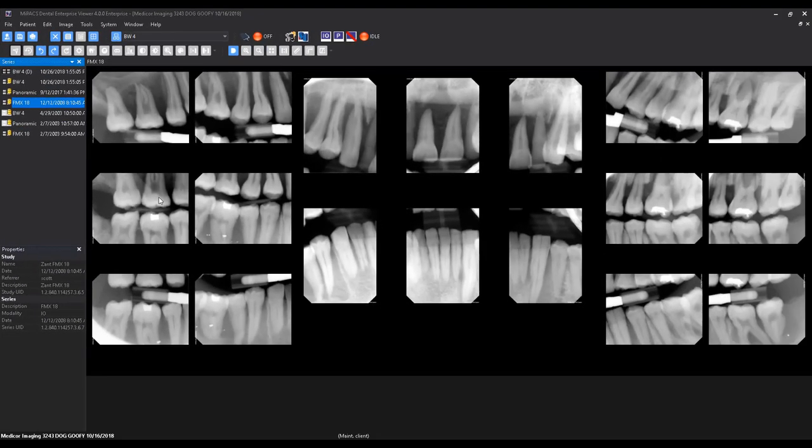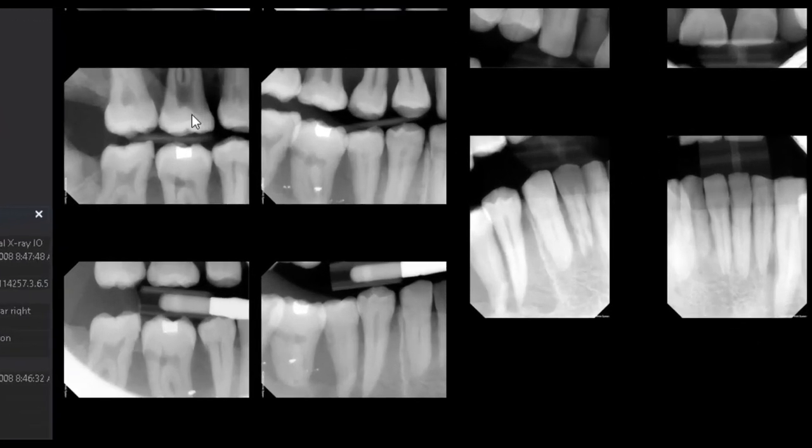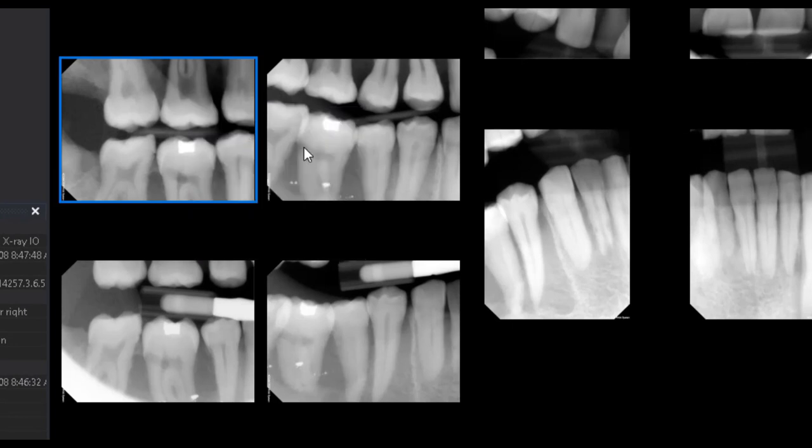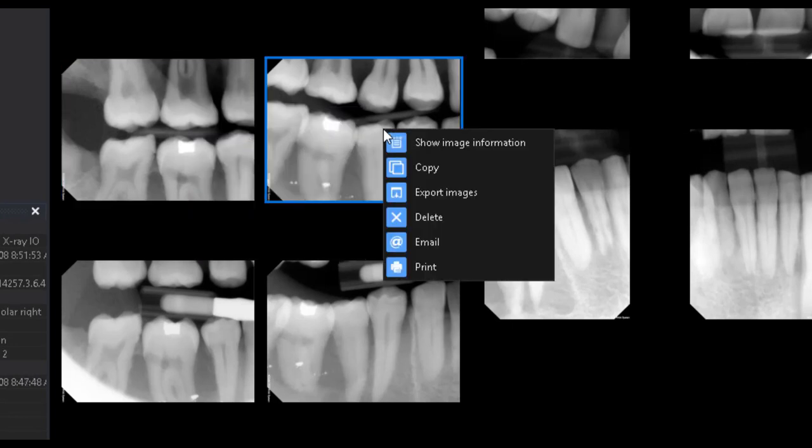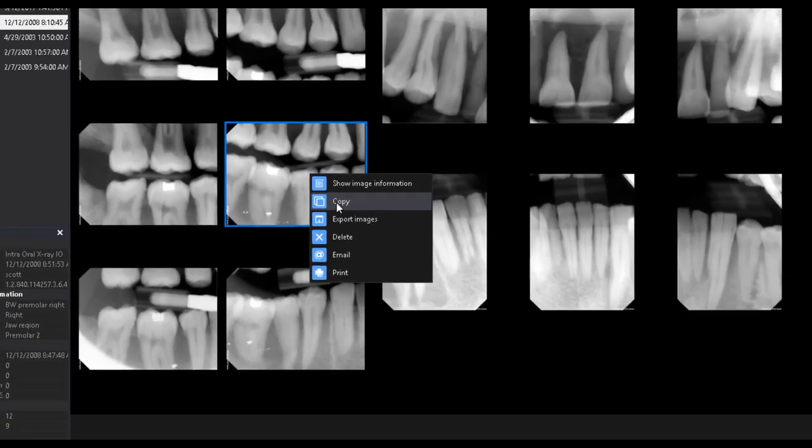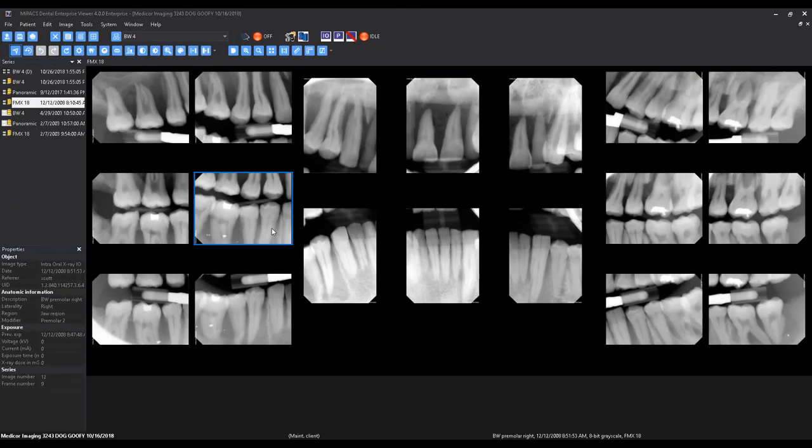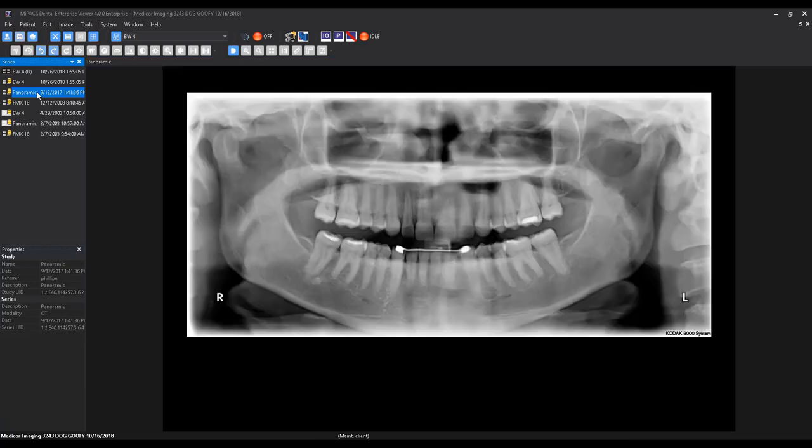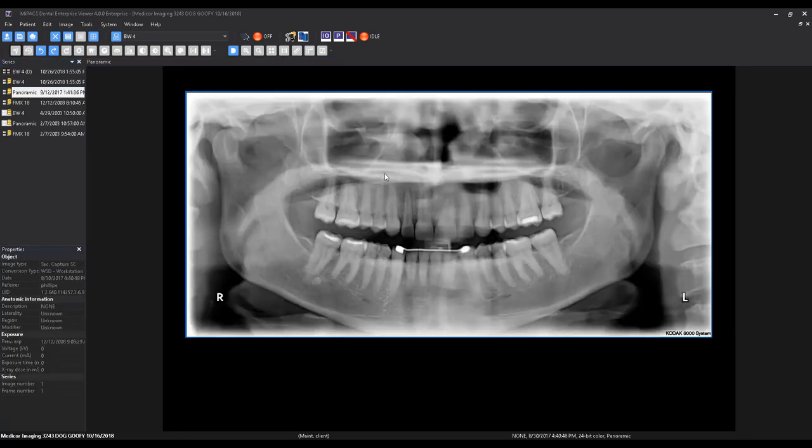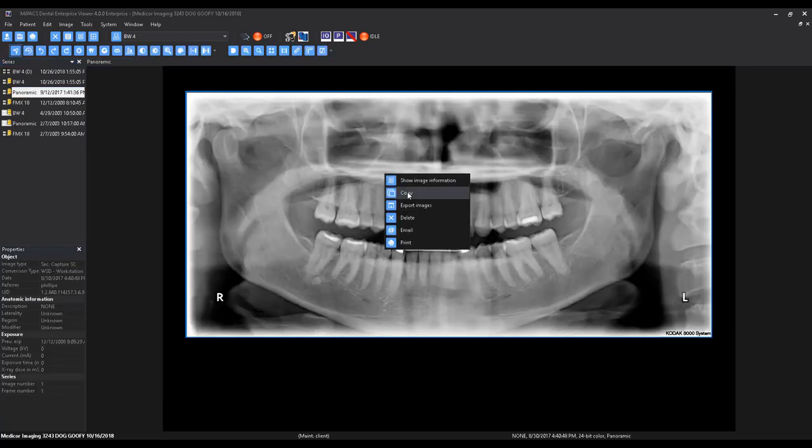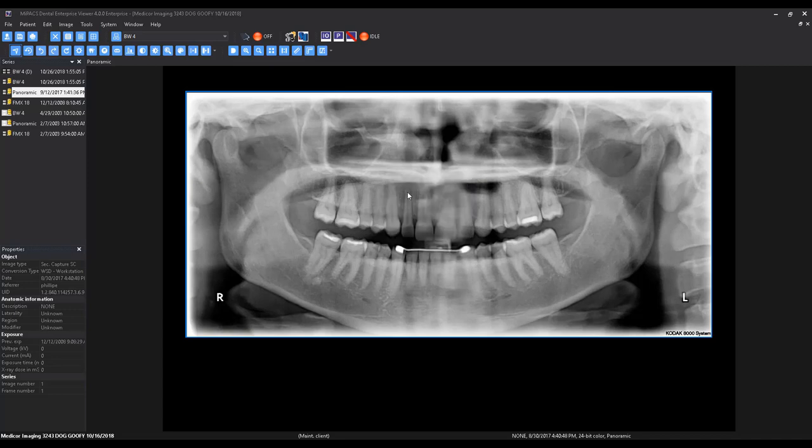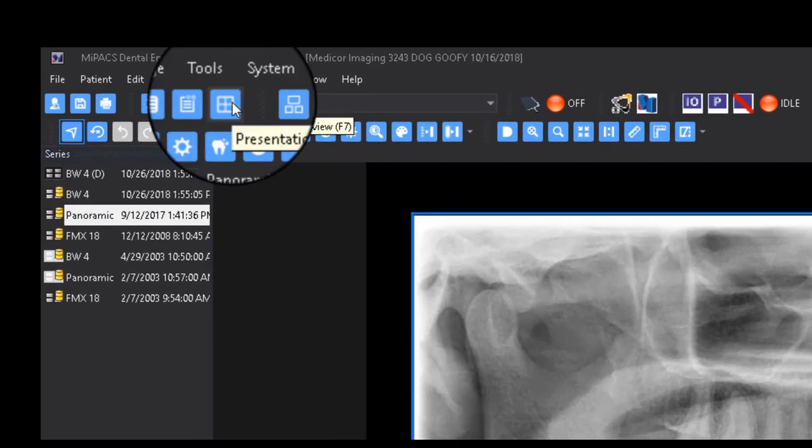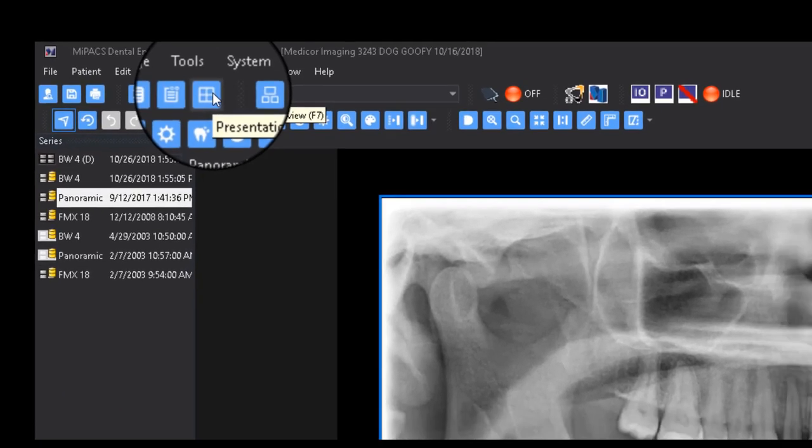After the clipboard has been cleared, right-click on any image and select Copy to add it to the Windows clipboard. Repeat this process for as many images as you would like to compare simultaneously, from as many series as you would like. Select the Presentation Overview button to display all copied images on screen at once.